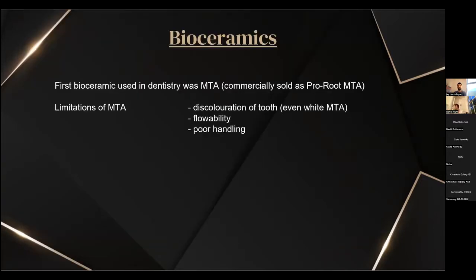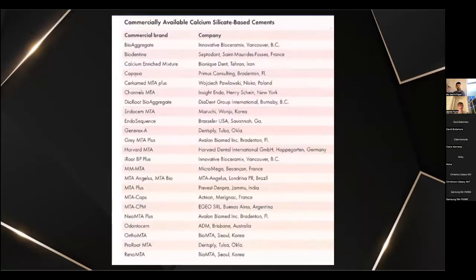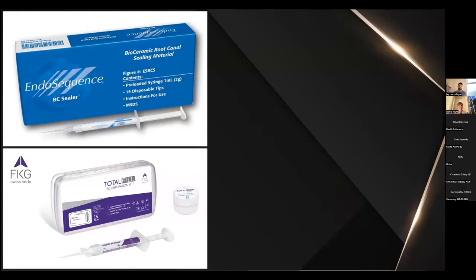It didn't flow very well. It's difficult to handle, very difficult to mix. Well, I found it difficult to mix anyway. They found out much later on that it was bismuth oxide, which they use as their radiopacifier, that caused the staining. Once their patent expired, there were a lot of different products. This was actually from, I think, 2016. Most companies took their turn at making either some sort of MTA-based sealer or a new MTA. The more popular of these a few years back were the Endosequence BC sealer or the Total Fill. These are made by the same manufacturer, just marketed and sold by different companies.